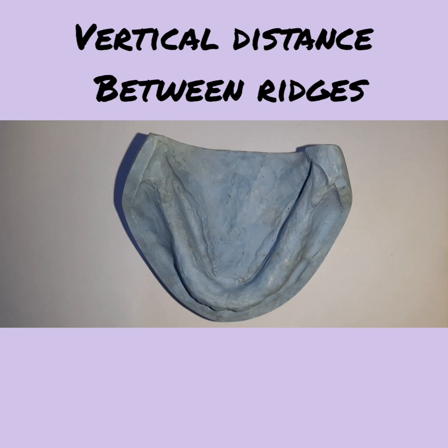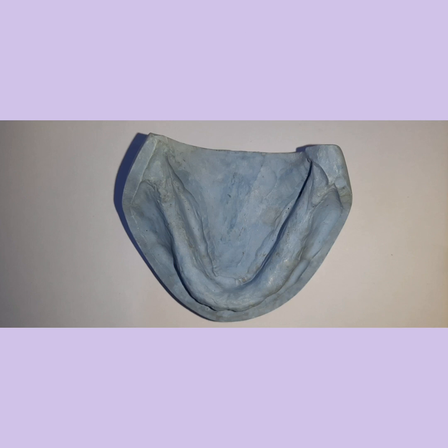Next method is vertical distance between the ridges. We had already talked about this in jaw relations, that the length of the teeth is determined by the amount of interarch space. The greater the amount of space available, longer teeth can be used, and if you have inadequate space, then you should use smaller teeth. The denture base you can also characterize or personalize to give a more natural look to the patient.